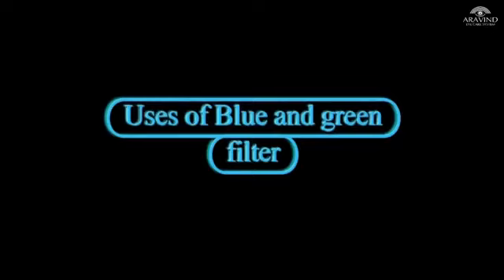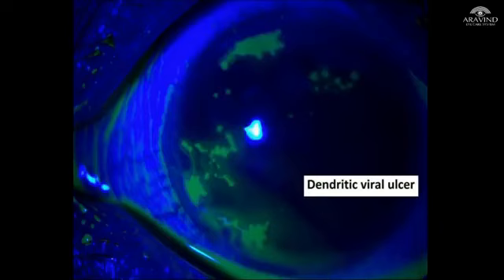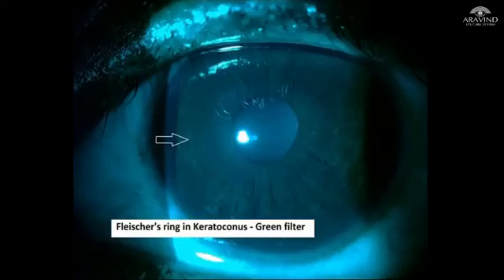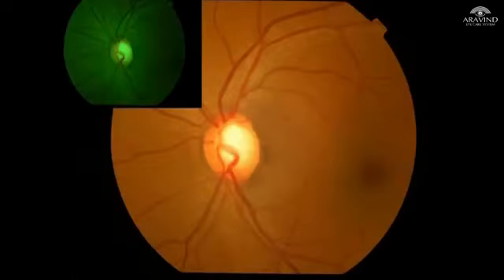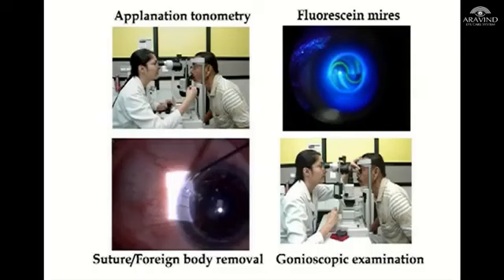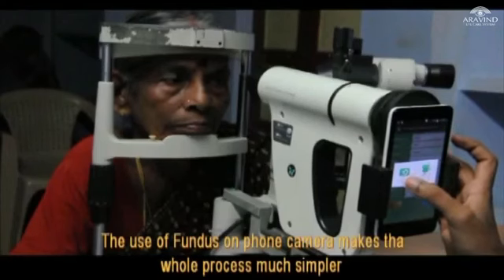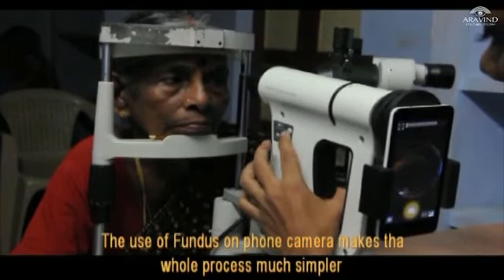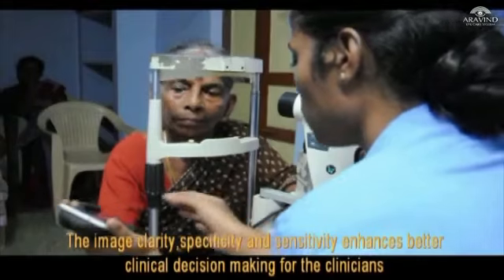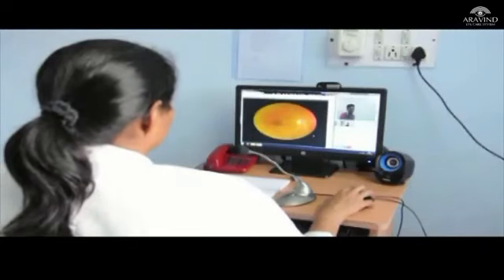Moving on to the various filters, a blue filter shows a dendritic ulcer, corneal and conjunctival epithelial defect, whereas a green filter can be used to appreciate the Fleischer's ring in keratoconus and retinal nerve fiber layer defects in glaucoma. Recent innovation in slit lamp, which has revolutionized the whole process of fundus screening, is a non-mydriatic remedio fundus camera that is successfully used in our vision centers for teleconsultation.